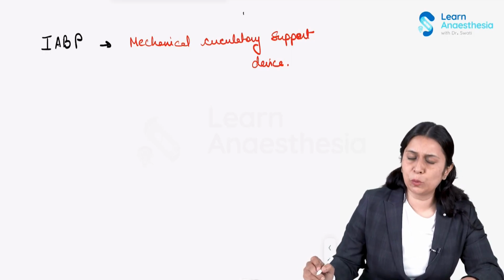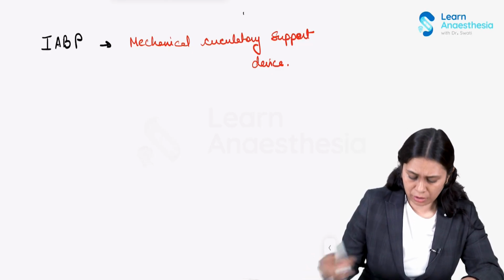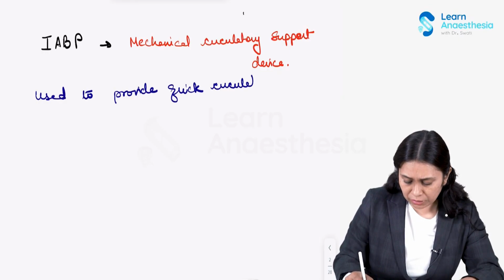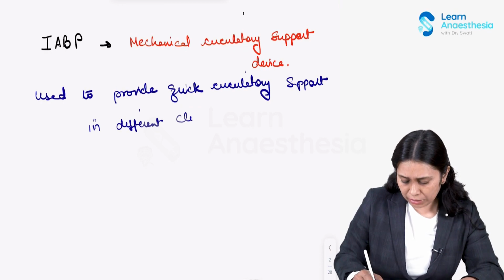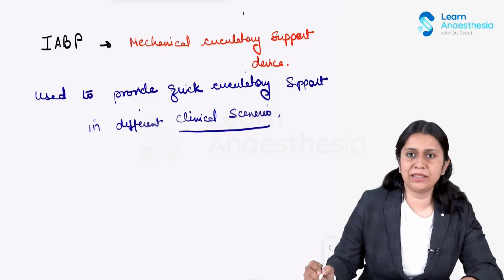It is used to provide quick circulatory support to the failing heart during a number of different clinical scenarios like cardiogenic shock, your refractory angina, as I just mentioned.